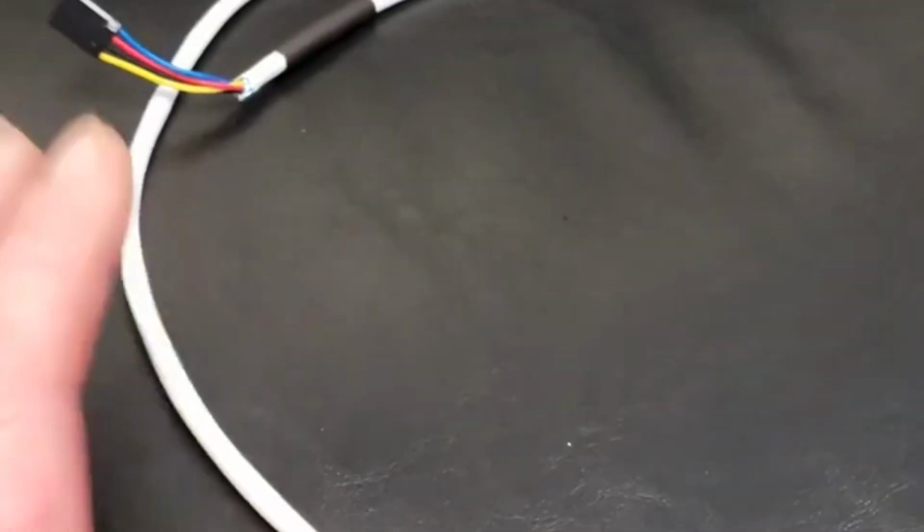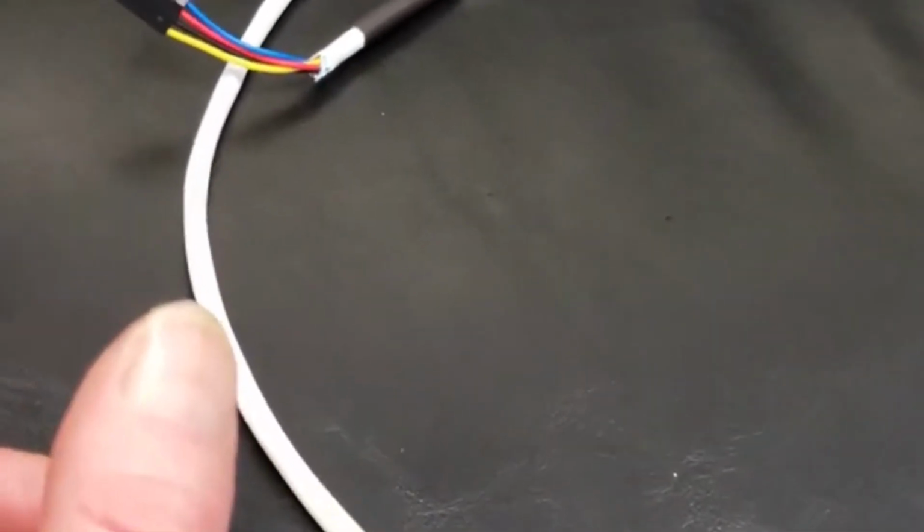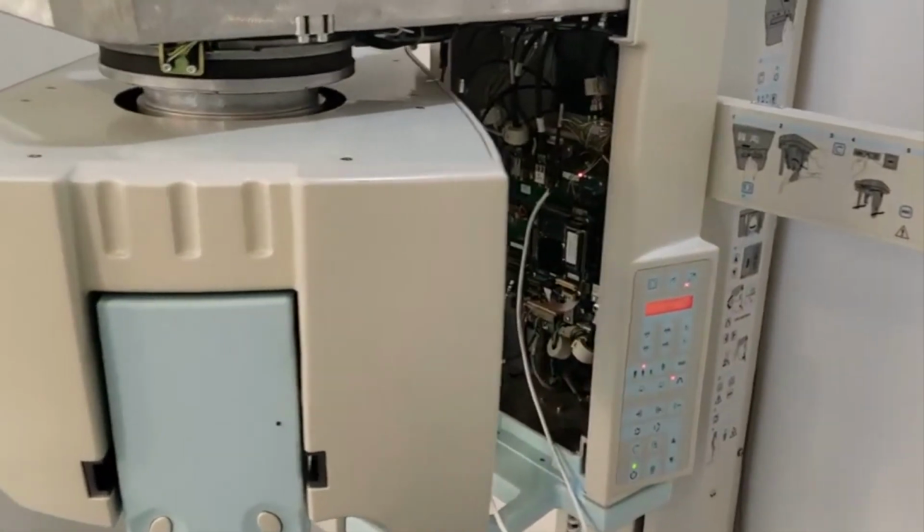This is actually pretty easy to make. The most expensive thing was the crimper. It was like 20 bucks. The other wire. Let's see if it works.